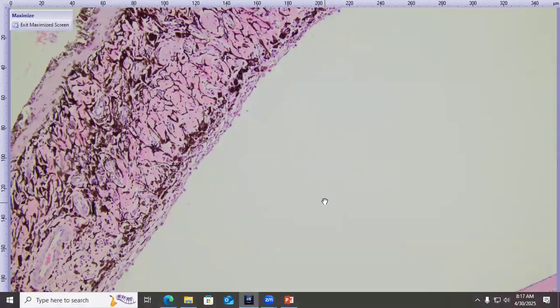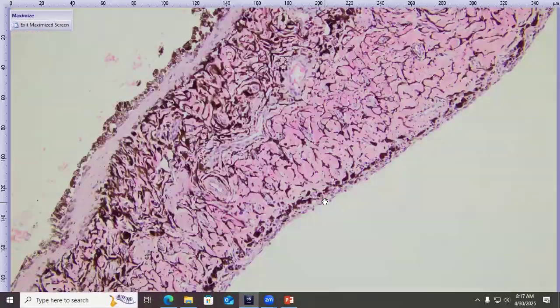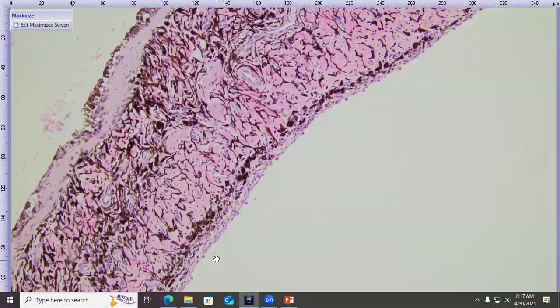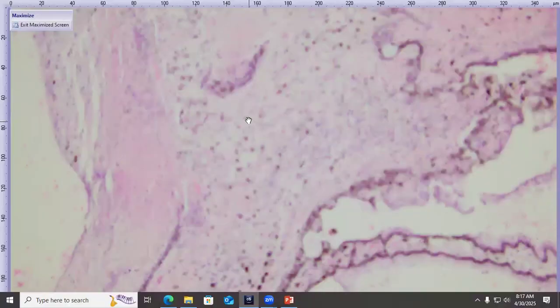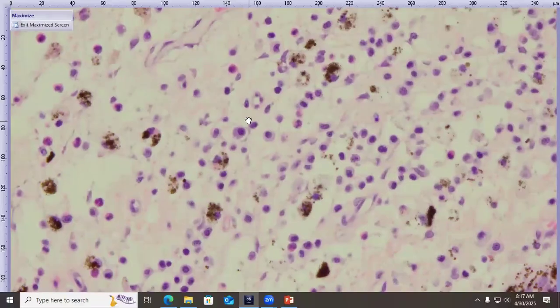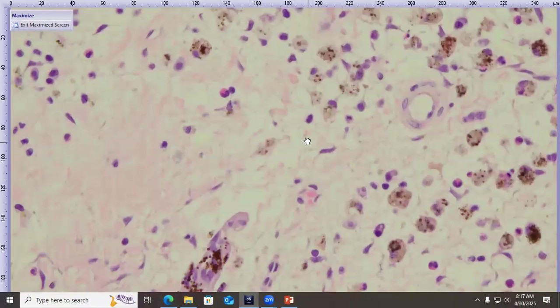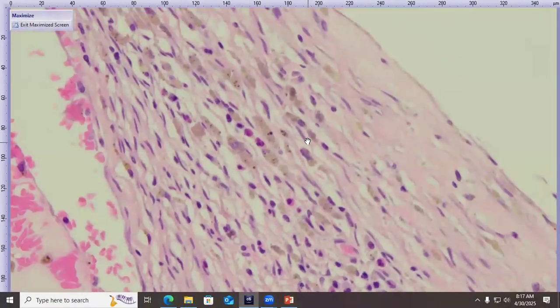So they did say yes to glaucoma. We have a large mass in the ventral iridocorneal angle. And dorsally, we do have this kind of thin fibrovascular membrane, and it is causing peripheral anterior synechia. So we do have a couple good secondary reasons for glaucoma in this case. And then looking at this membrane, we have more of these little scattered round cells and eosinophils that spread all throughout the membrane as it goes over the retina as well, and some hemosiderin-laden macrophages.